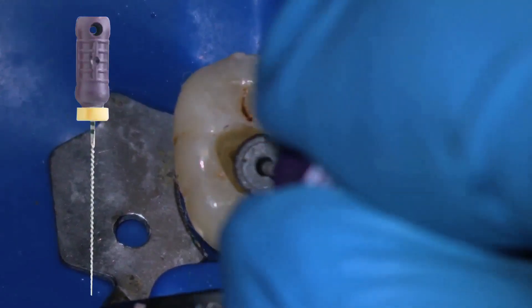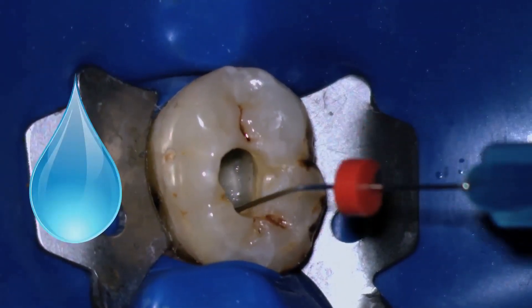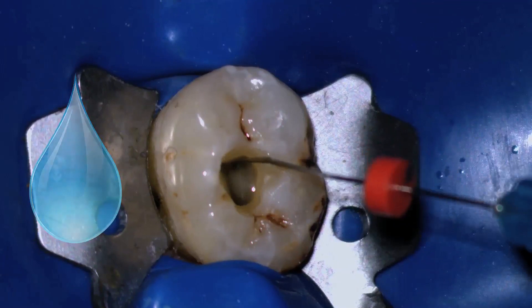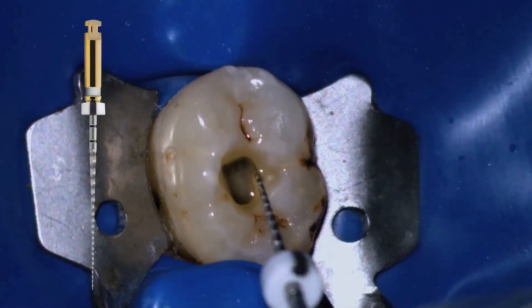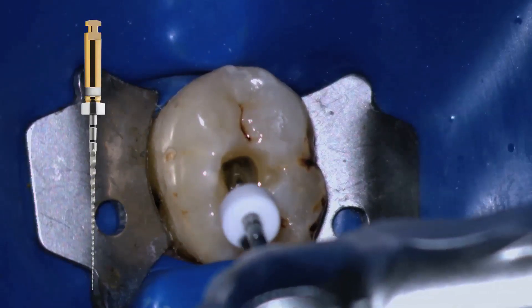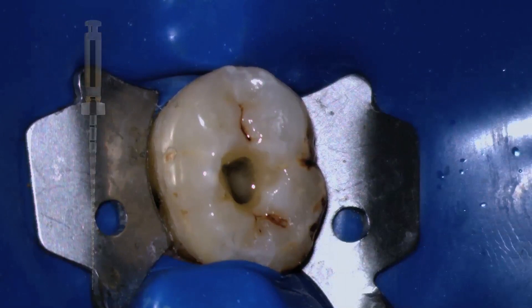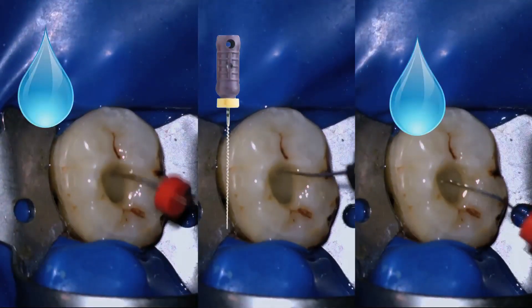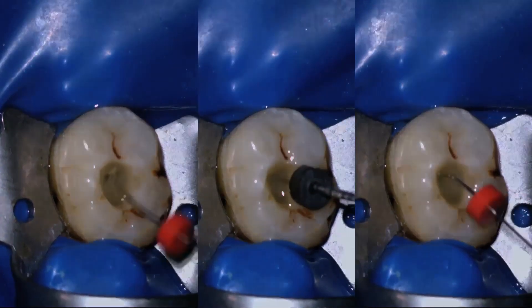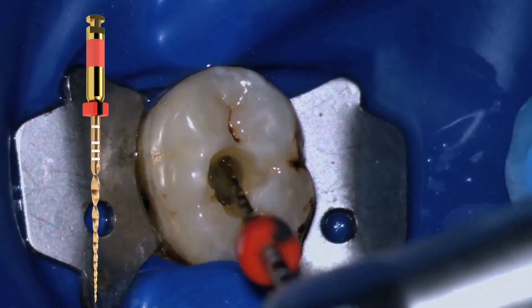Once we ascertain that patency, we need to create the glide path with the ProGlider rotary instrument. We are irrigating here, and the pulp chamber has to be flooded — always flooded with the chemicals we use, in this case sodium hypochlorite. After establishing the working length, we create the glide path with the ProGlider, going little by little in amplitude strokes of three millimeters all the way to working length. Sometimes it takes several steps to achieve this length. After that we irrigate the canals and verify that the canals are still patent, making sure we have not blocked ourselves.